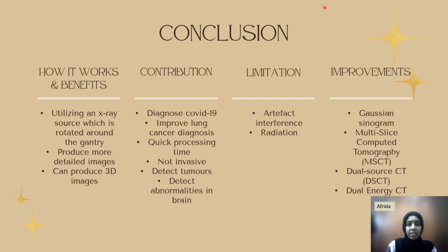However, CT scanners have their limitations as well. Some of the obvious limitations are the artifact interference and the radiation. A lot of suggestions to overcome these limitations have been made by researchers, as well as doing clinical trials to prove the efficiency of the improvements.